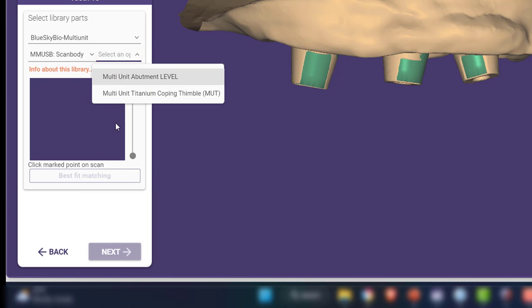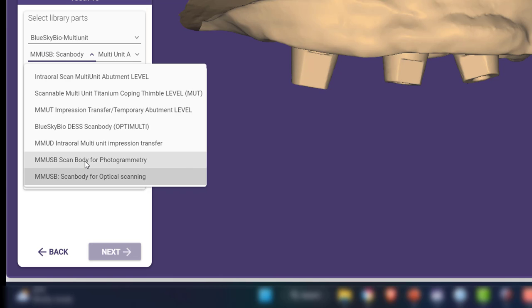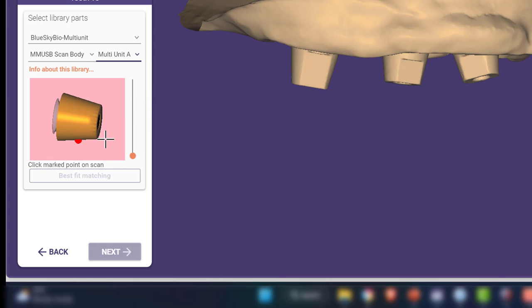And if that was chosen, let me just show you here. If that was chosen, it would bring in the one that has the flats present. And I would just be clicking on the model for the intraoral scan, but that's not what we're doing. We want to choose the one for photogrammetry, which is going to bring in the one that has the cylindrical portion. The Blue Sky multis are not ideally set up for just going direct to multi-unit, or I should say the Blue Sky screws are not ideally set up for it, but let's just do that for simplicity's sake.